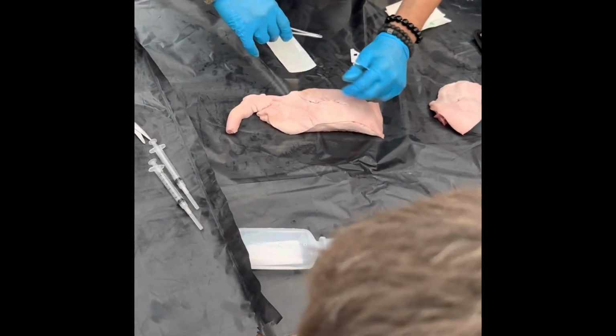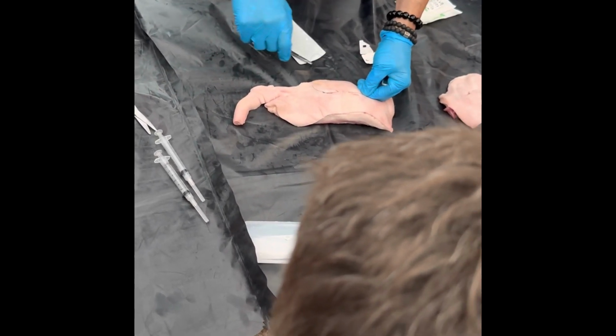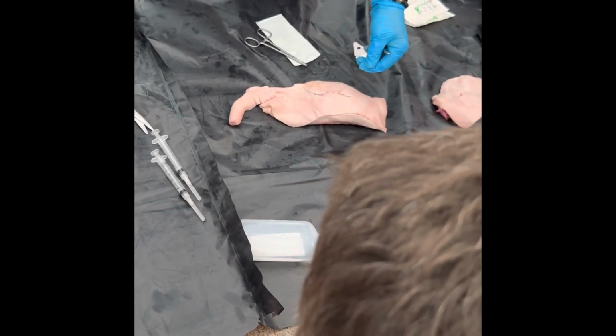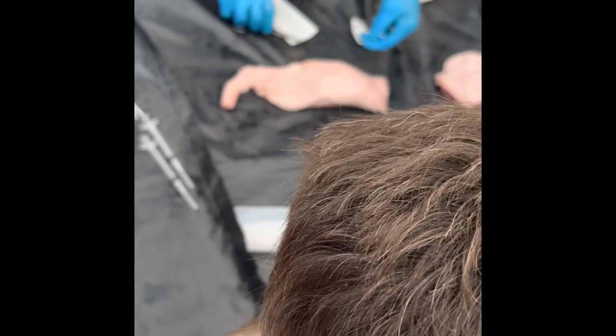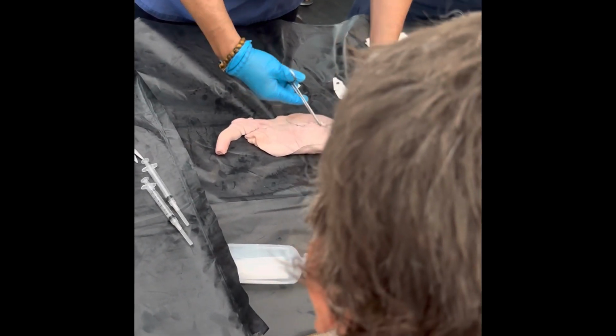So would you only do this if you're in a hurry, or what's the advantage to the other way? It looks nicer in the end. You don't knot every stitch. Most orthopedic surgeons will do this one. And if you notice, it looks nice, but most of the time when we do it quickly, it puckers a little bit. You notice the difference between this one and the other one, right? Is that because it's not knotted? Yeah. And I'm just going in, I'm not going in real deep, I just want to get in. Go.